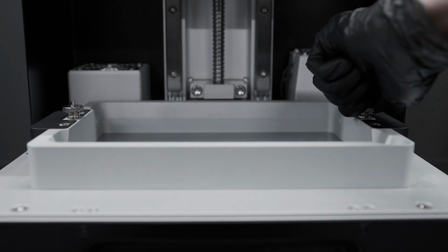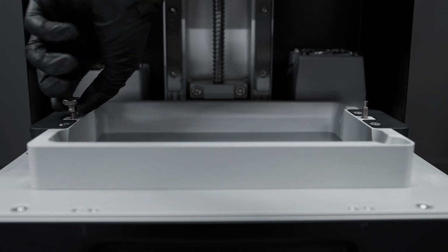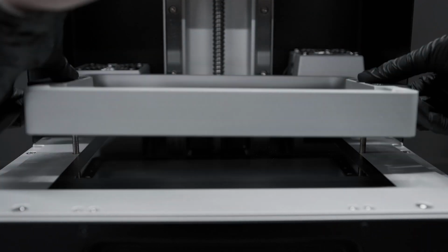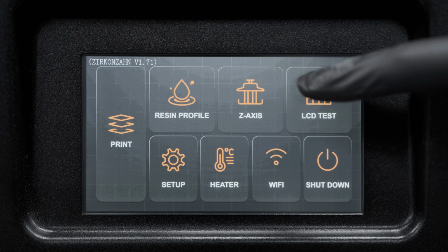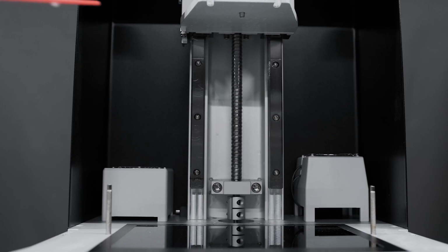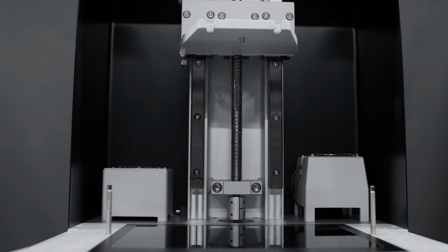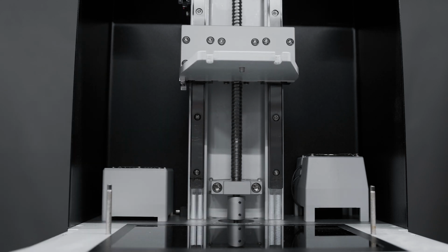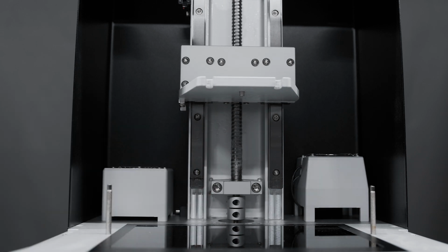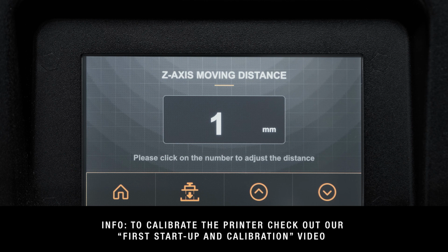Remove both the building plate and the resin vat. Select Z-axis and then press the second icon. The Z-axis will move downwards. Lubricate the Z-axis every 20 or 30 mm while it is moving. Then, perform a calibration process by clicking on Z-axis and the second icon once again.